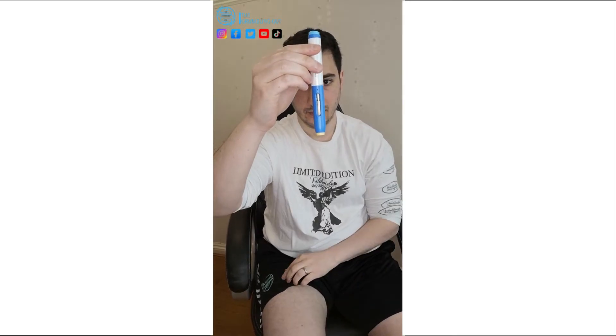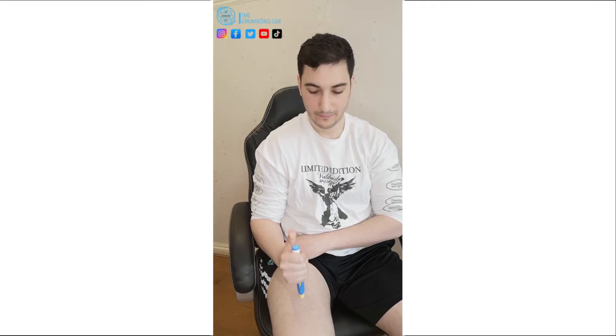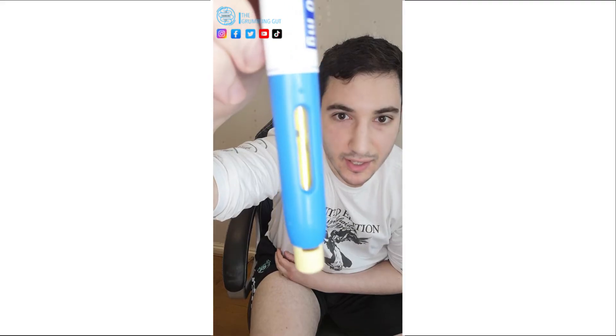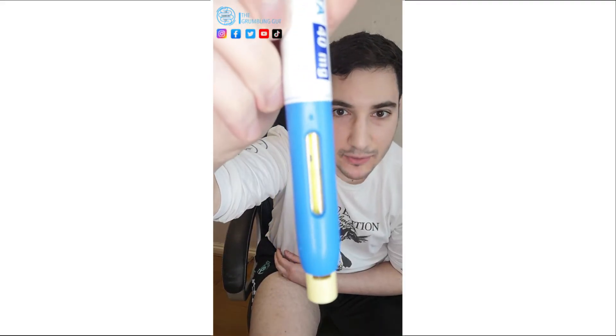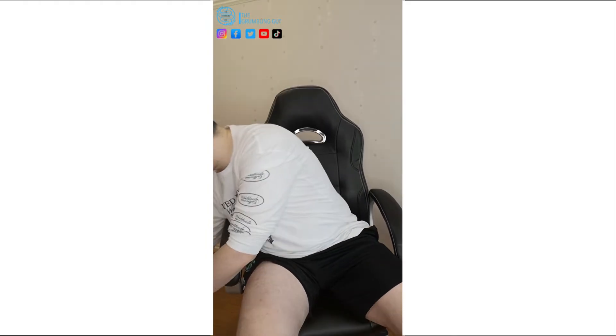Yellow stopper — pull it out. Check the fluid, all seems good. Then press in — one click, two clicks — wait for five seconds. And that's it. You can see how it's gone yellow; that means it's all finished.